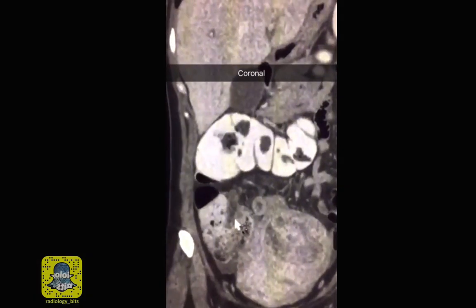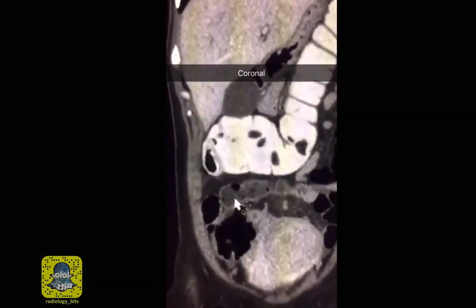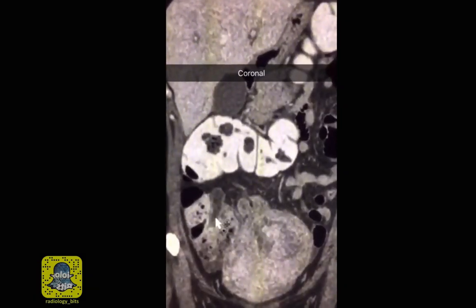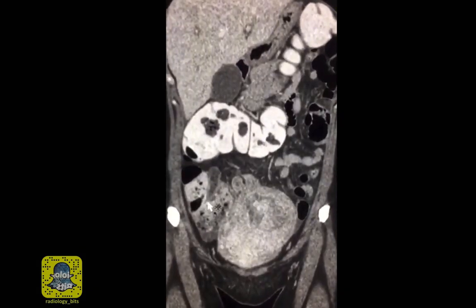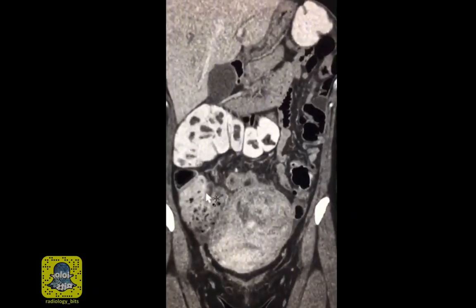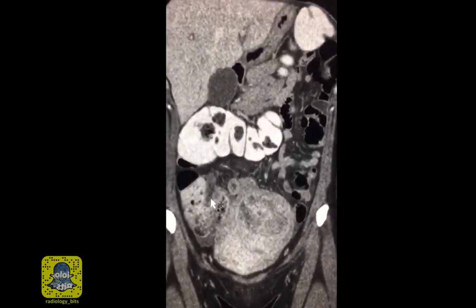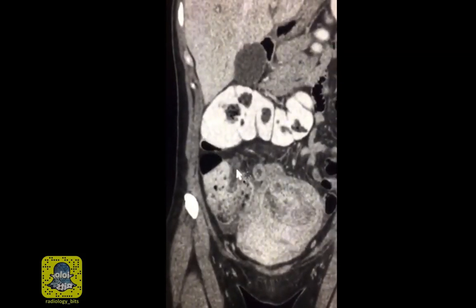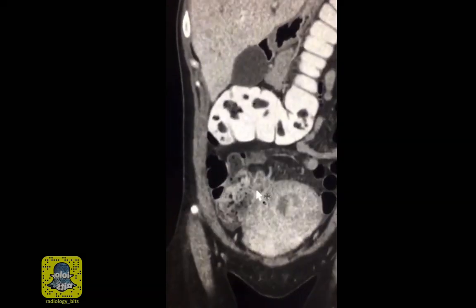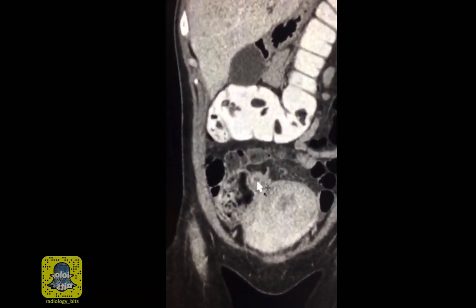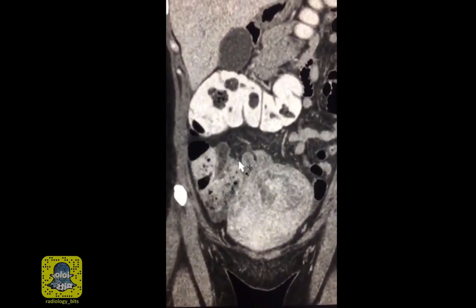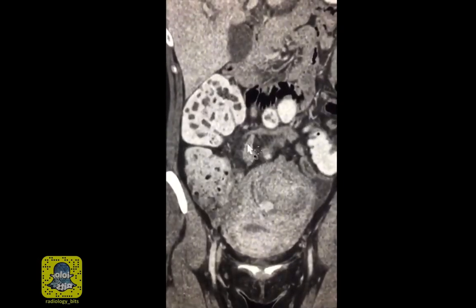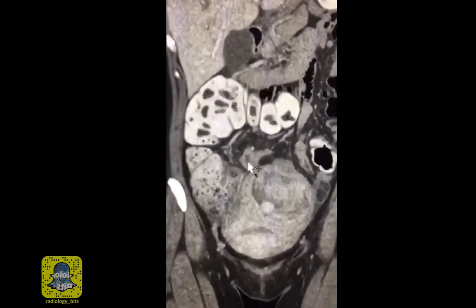Let's conclude the case by showing the terminal ileum as it goes into the cecum on this coronal image. Looking at the coronal and sagittal images makes finding the ileocecal junction easier. Once you identify the cecum and the ileocecal junction, look around it — particularly beneath it — and you'll notice that the base of the appendix arises from there. The appendix has all the features of acute appendicitis that we described on the transverse image. This is a thick appendix, and this is the tip here.